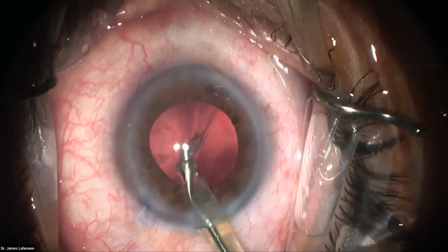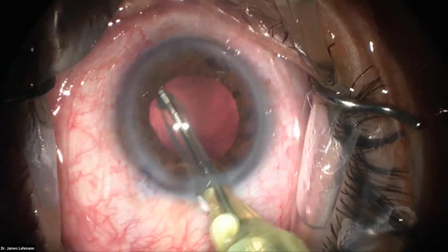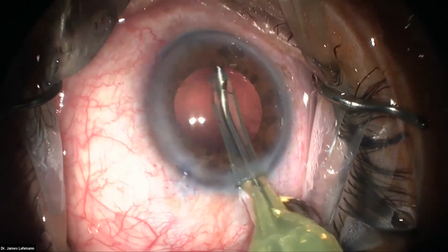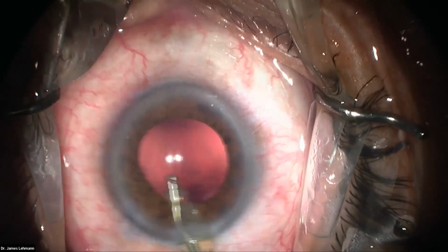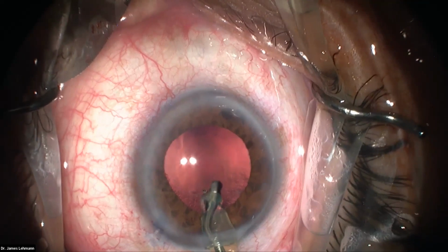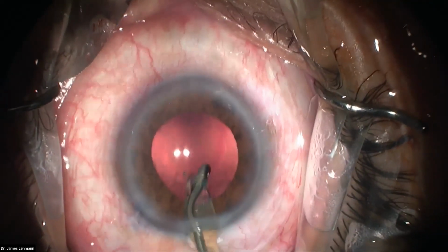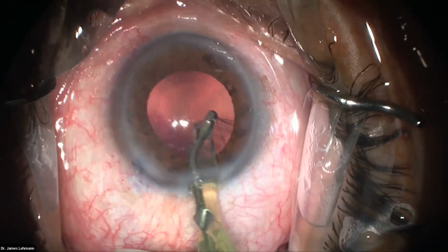The central part of the capsule is clear. Just these little cortical remnants that are there. And this will just help with cleaning up that capsule. But I don't need to go sub-incisionally and get much here. Maybe a little bit of that cortical debris. It's kind of hard to get. There you go. We can maybe get it once the IOL is in.